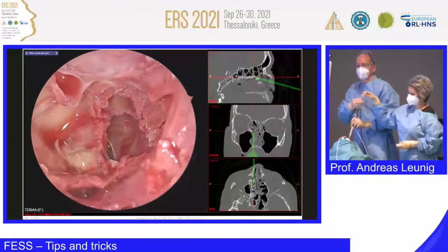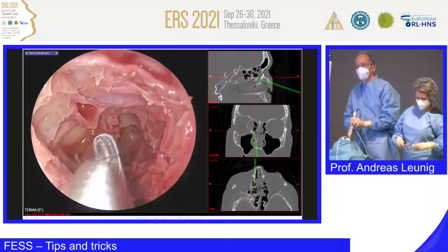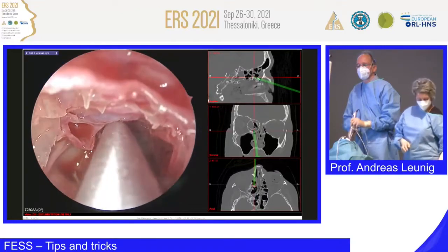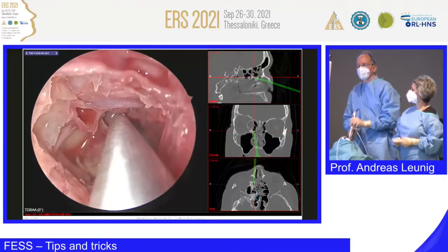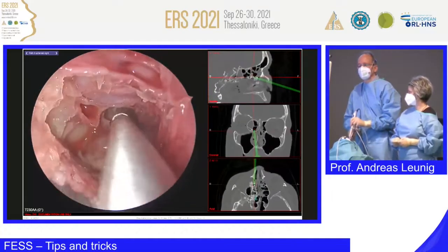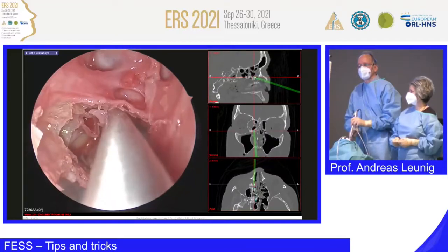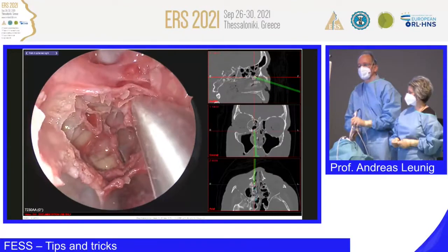Okay, once again the large elegant punch. Oops, I'm going a bit higher up. So we expose it, and now we want to have navigation. Oops, that's what you should avoid. There's some bony lamella still there. I can feel it, I can see it. But as long as you have navigation, just use it.